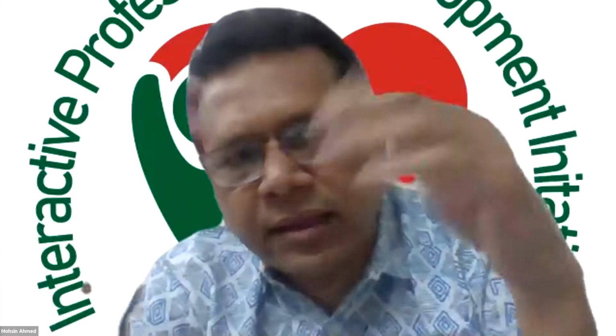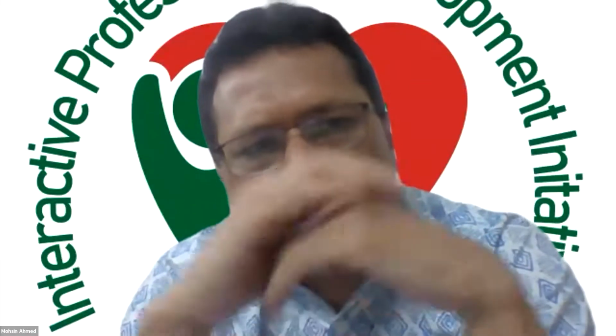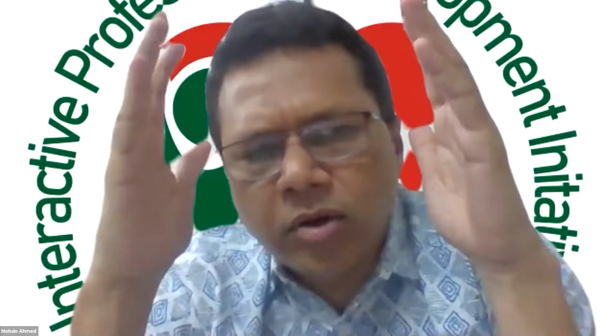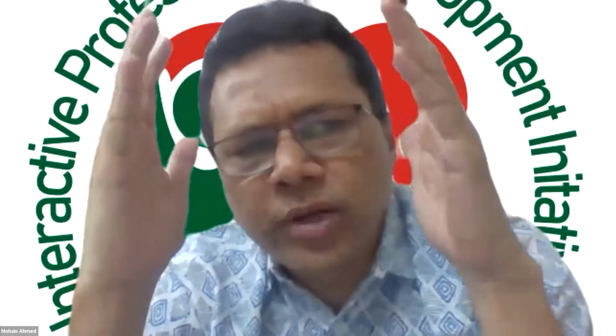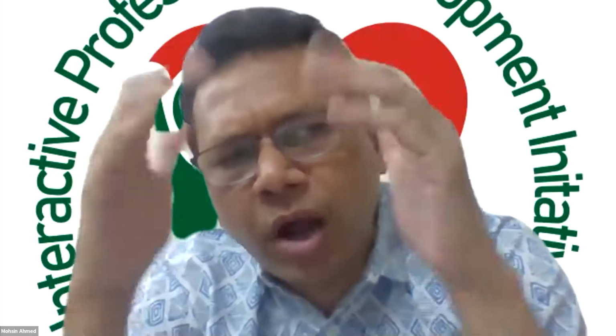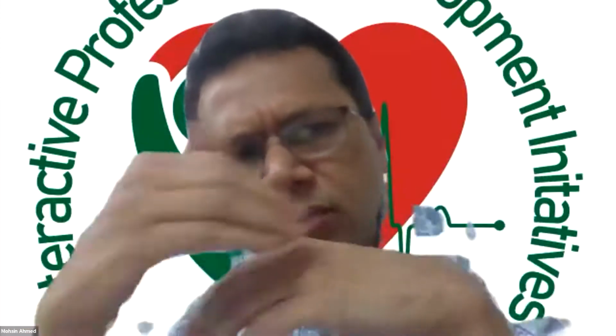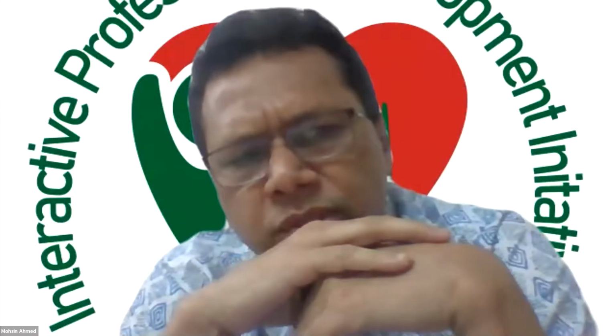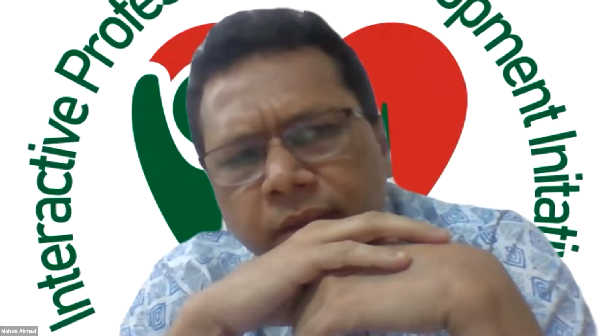For preparing the cath labs, your lecture is an extra lecture for the juniors, but first you must set your mind and become confident about which channel is most used. How do the fellows decide which channel is important for the success of retrograde PCI? How do you usually decide, for the fellows?